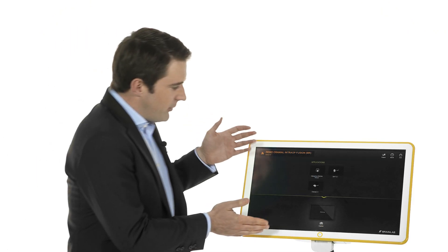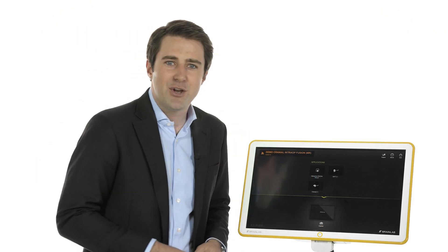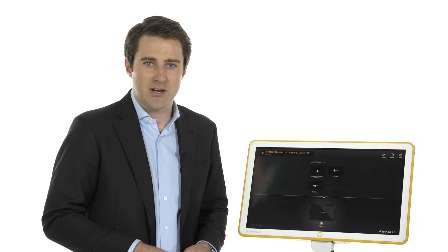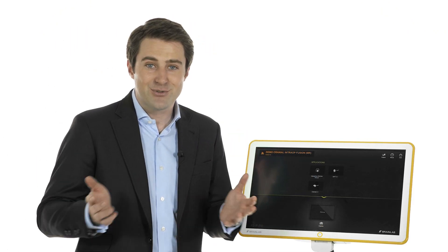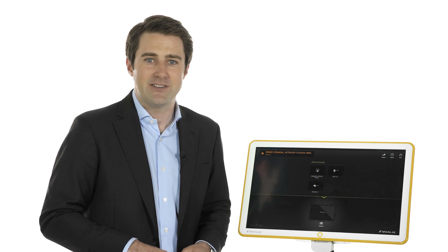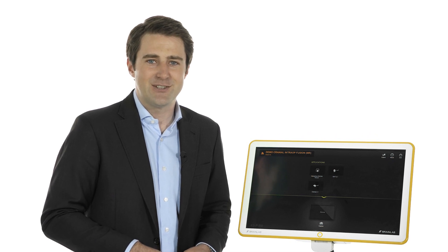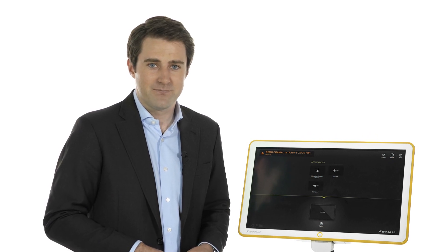The drapeable high-definition monitor provides excellent image quality and, true to BrainLab navigation platforms, utilizes intuitive touchscreen control.